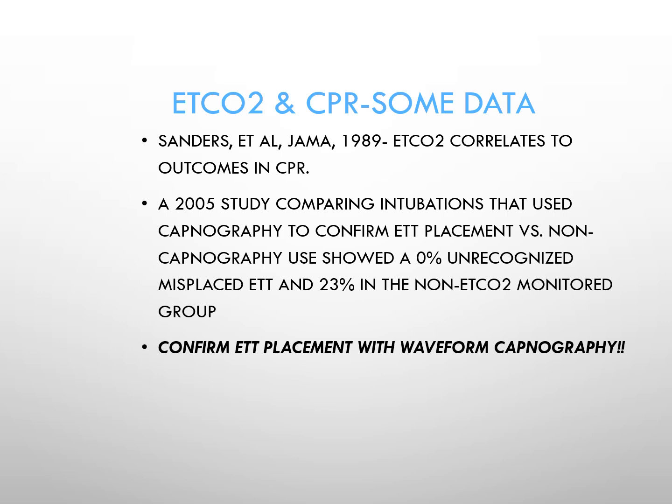A 2005 study compared intubations that used capnography to confirm ET tube placement versus other methods, and it basically showed a 0% unrecognized misplaced ET tube versus a 23% unrecognized misplaced ET tube when capnography was not used. So the moral of the story with this slide is to confirm ET tube placement with waveform capnography.